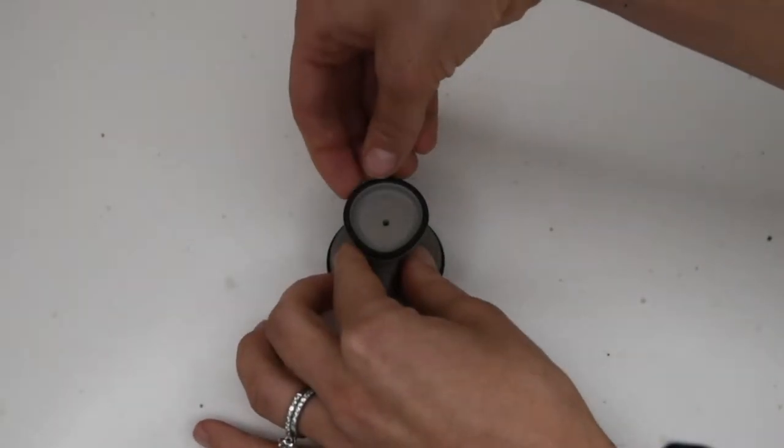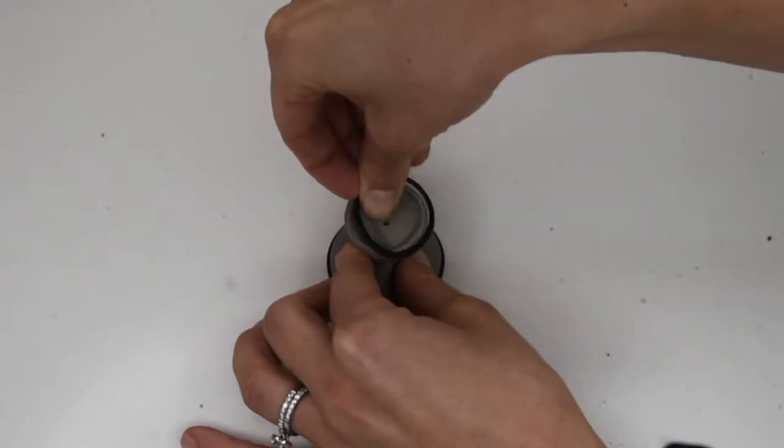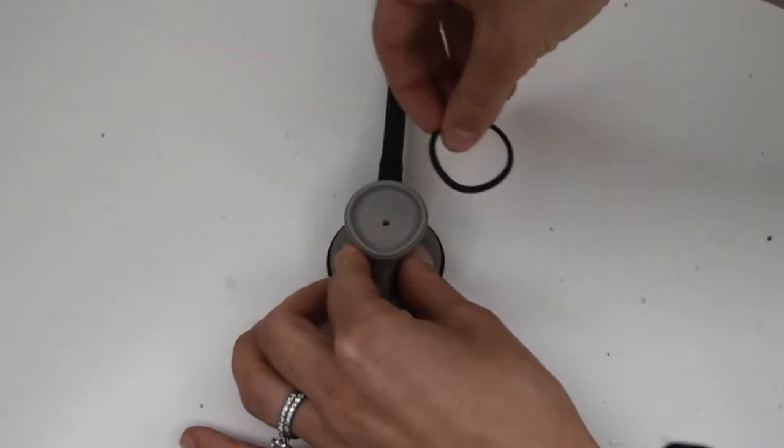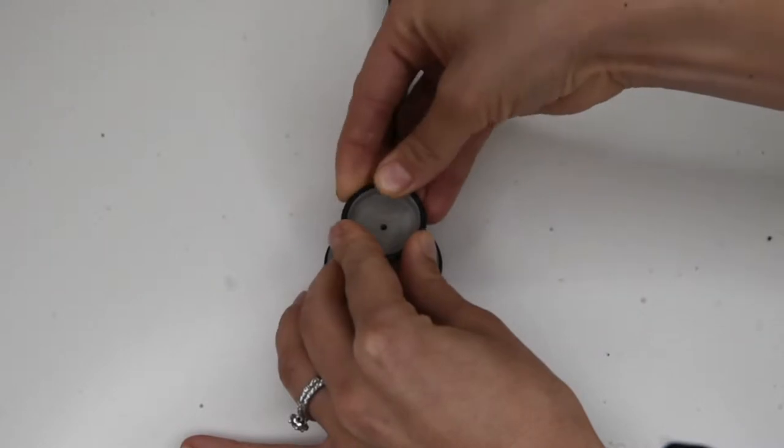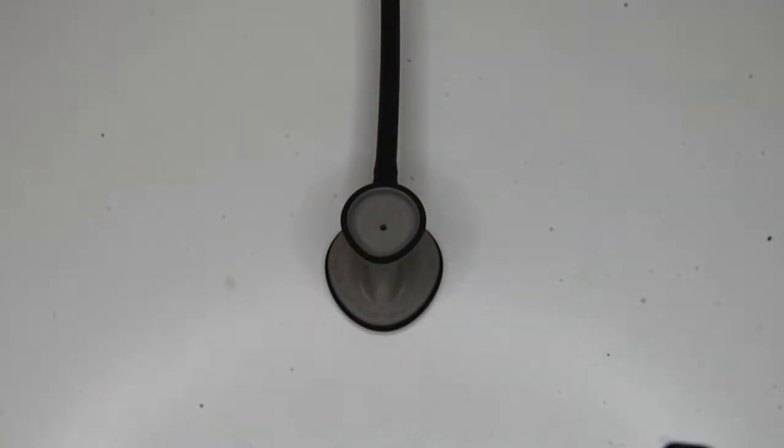Taking off the non-chill rim is super easy. You simply take your nails on the non-chill rim and lift it slightly and pull it off. It'll come off really easy. To put it back on, you just put it back on top of the chest piece, work your fingers all the way around and it will snap back into place.